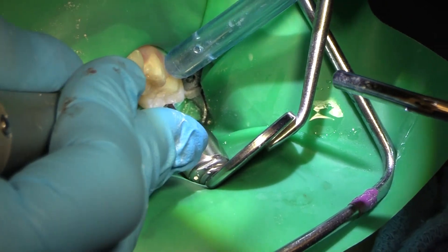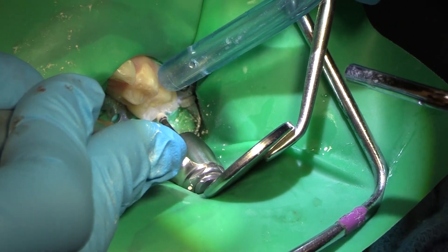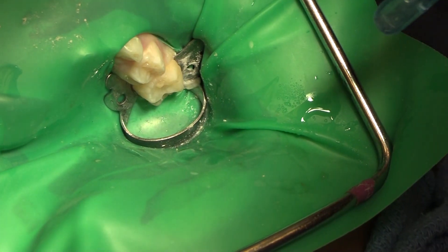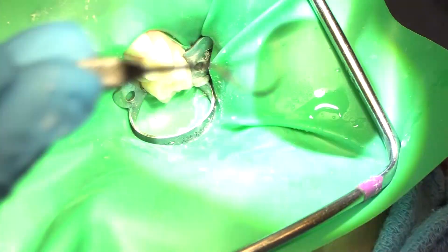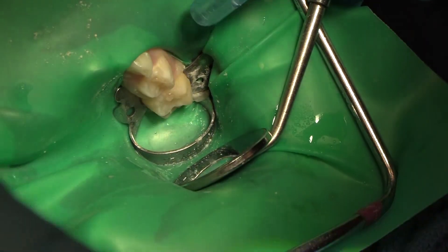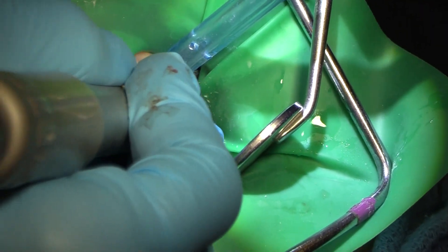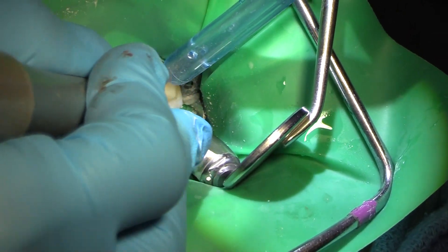Not just how far down, but how wide — because composites in kids, we need to be conservative if we want some success. It's not the same as doing a composite in an adult, where you've got the ability of the patient to know that they've got a composite restoration and maybe be a little more careful. Kids are ruthless and they're going to chew and do things that you wouldn't want your patient doing on gentle dental work.